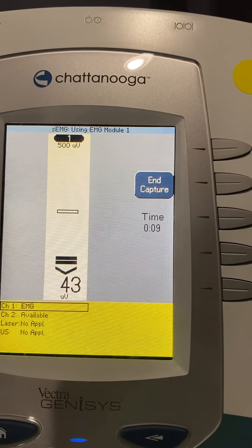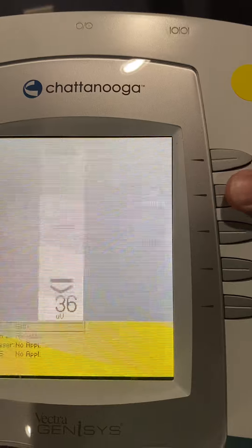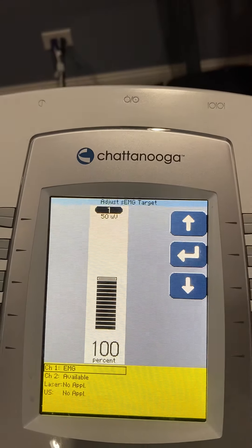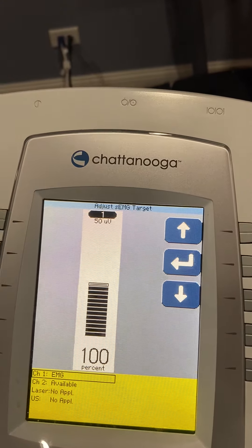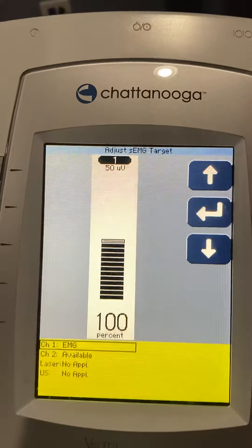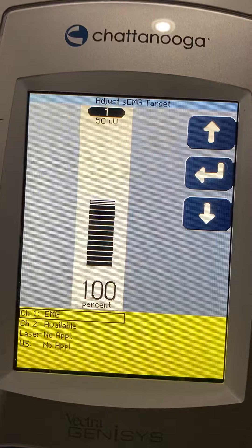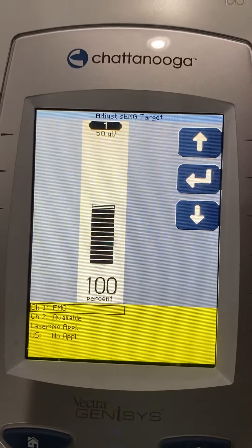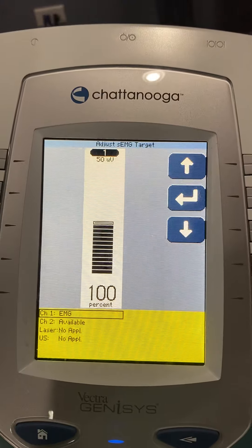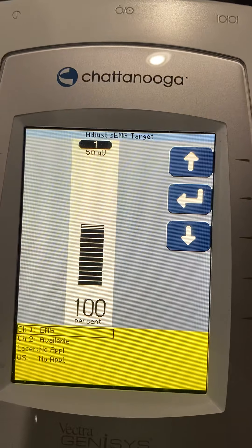Let me see how much effort varies. We'll end the capture, and it tells us her average was 50 microvolts. Now if we're trying to strengthen her, we're going to have her do a quadricep exercise and let her know when she successfully reaches at least 50 microvolts or above — wherever we set it.